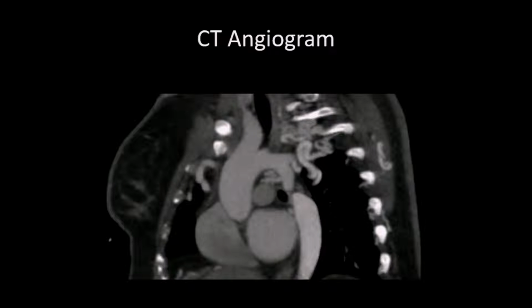You can see here the collaterals. You can see the collaterals near the vertebral bodies.